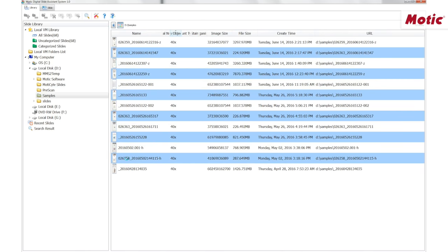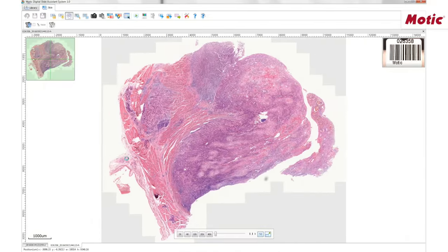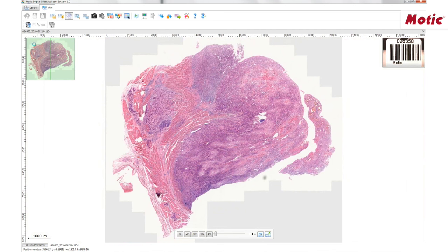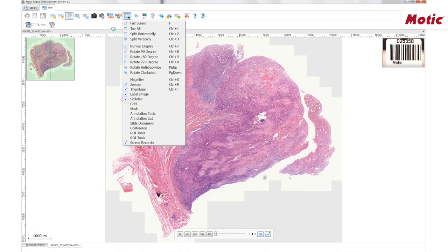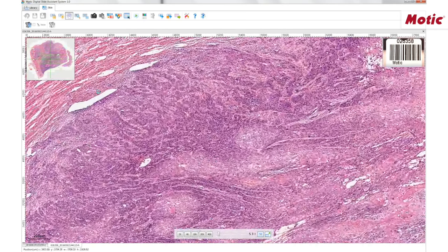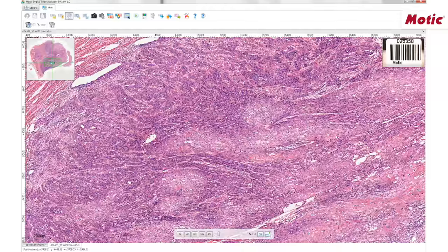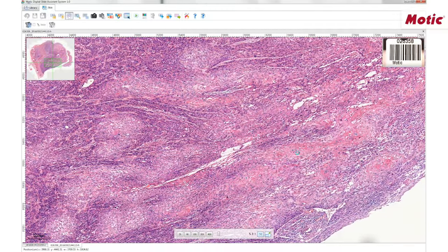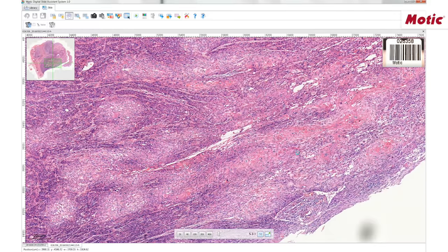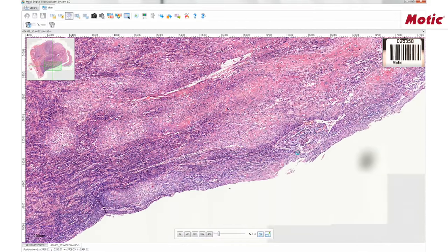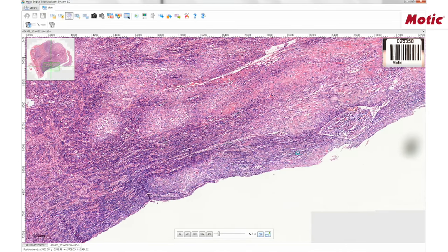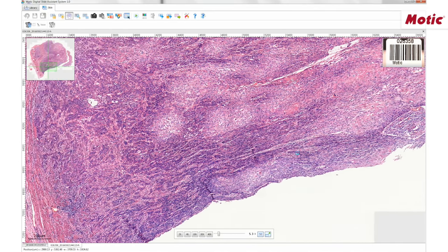If you click on one of the files, you immediately go to the slide edition tab. Here you have the slide thumbnail and the information for the barcode. On this menu, you can activate or deactivate different tools like the zoomer, the scale bar, grid, etc. And obviously you can zoom in and out on your image. If you need to screen the sample, just double click on the keyboard arrow keys in order to have a smooth movement in the four directions. To stop on the region of interest, just make a simple click.